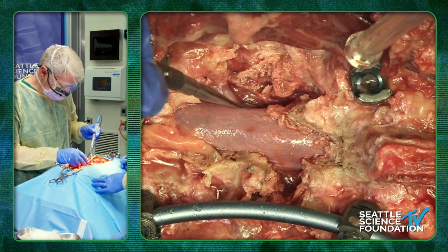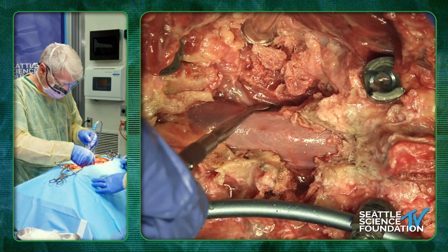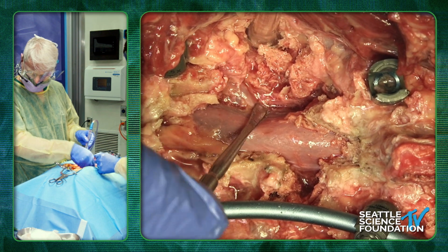So we do a little more retraction than we would like, but we try not to. So we have special nerve root retractors to help put a bit of a wall up there. So that would be, here, hold that there.